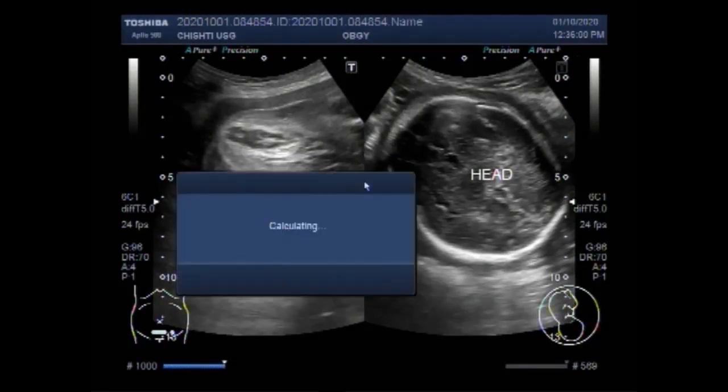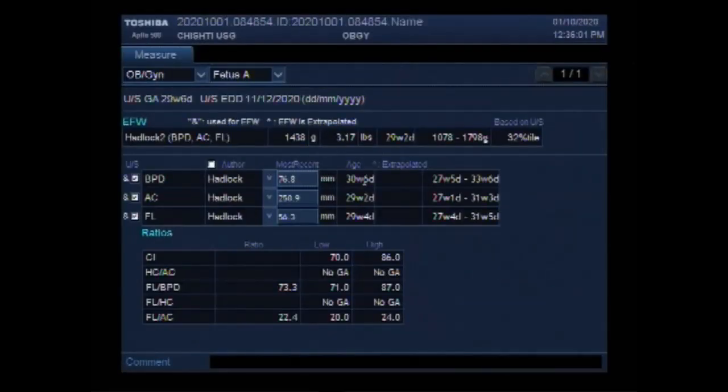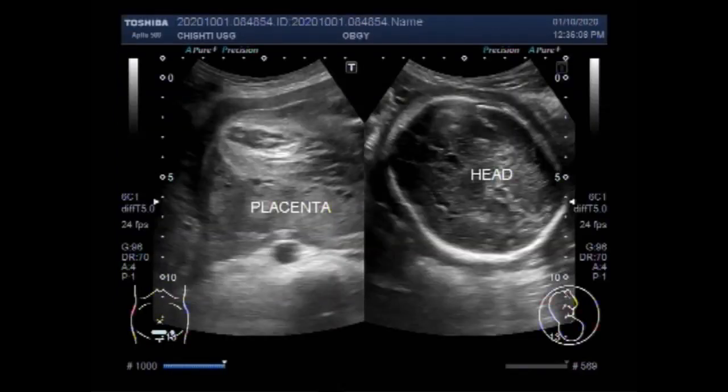Dear viewers, I hope you are all fine. This ultrasound video shows a pregnancy of about 30 weeks with oligohydramnios.